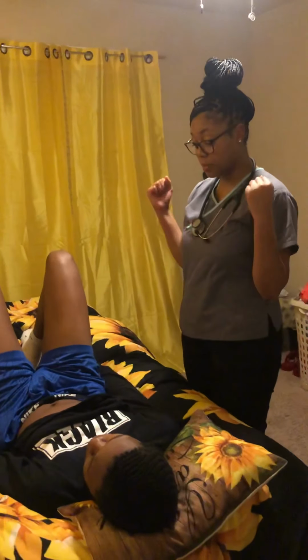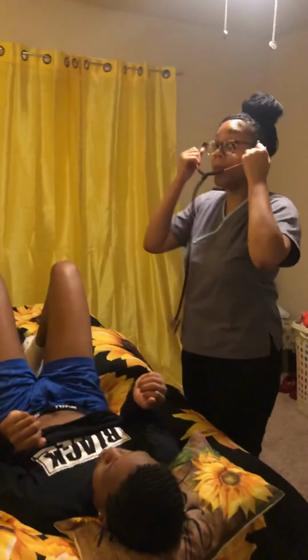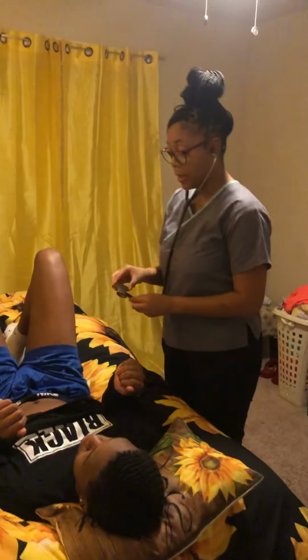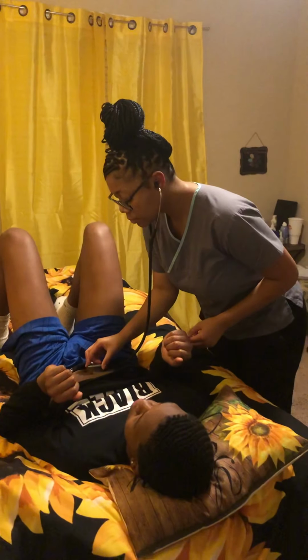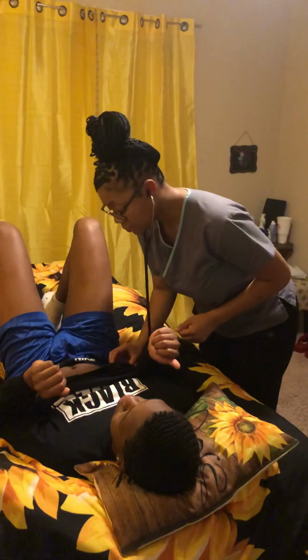The next thing that I will do is begin to auscultate for my patient's arteries. Would you hold your arms upward, bending your elbows? And this I will do using the bell of my stethoscope. Beginning with my patient's abdominal aorta. And now moving on to my patient's renal artery.